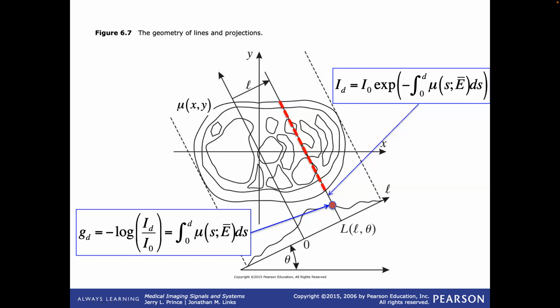And the machine is calibrated such that when you set two variables on the machine, you set the kilovolts peak on the X-ray tube. So that can range from say 70 to 140 kilovolts peak. So that sets the kind of spectrum of X-rays you get.